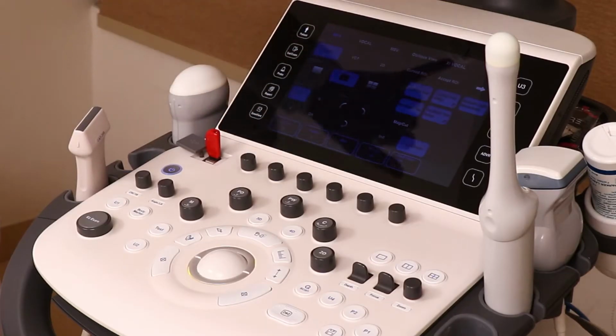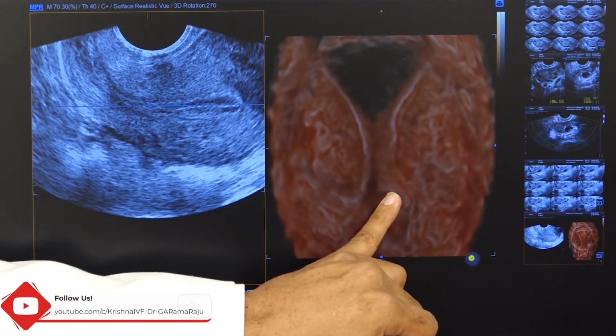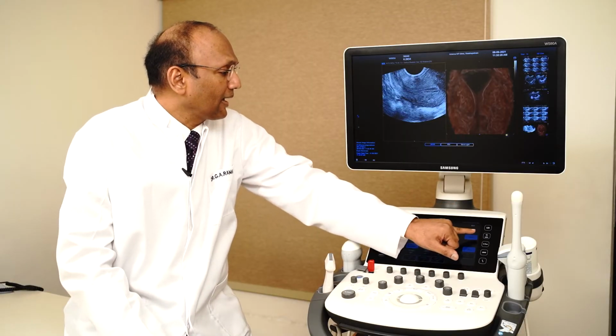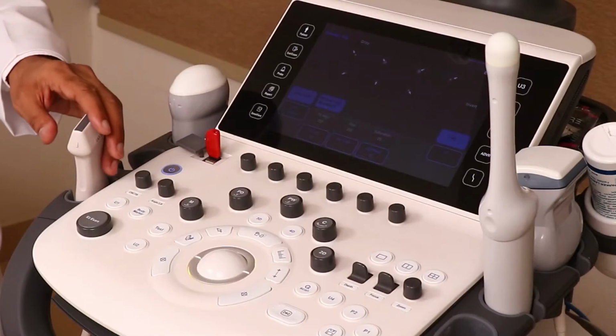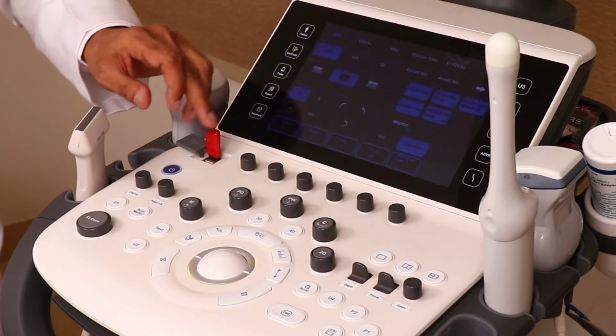If I add this image, what we look at here is entirely in a different dimension. And once I invert it back into the original position, I have the uterus. Then I can also look at this in a further different way, which I'll show you in a second.